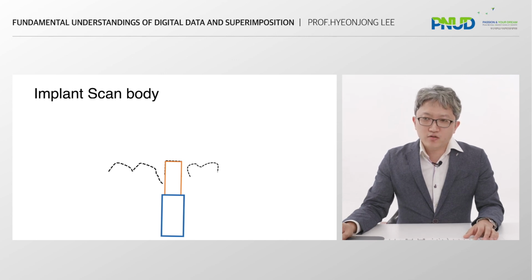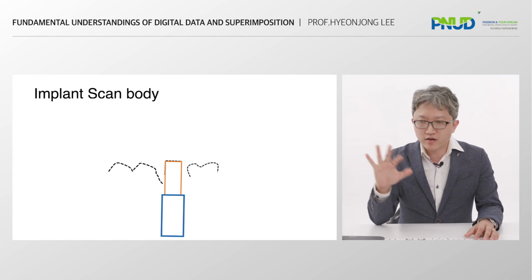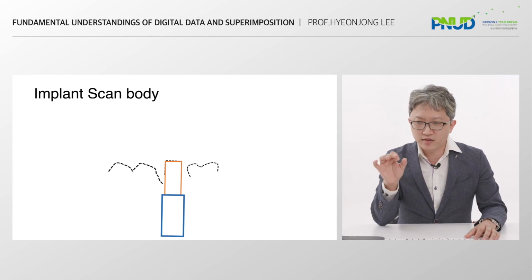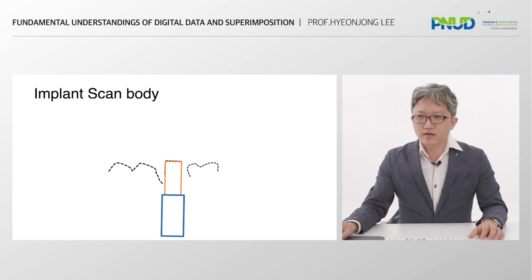When it's open on the mesial and distal surfaces, we shouldn't close them automatically, because when we automatically close everything, that reconstructed surface is not that accurate. So it can make errors compared to just leaving the surface unconnected.